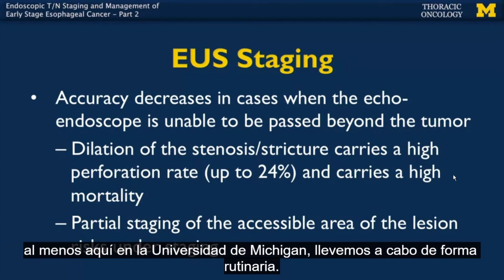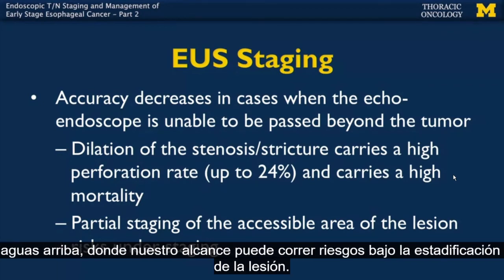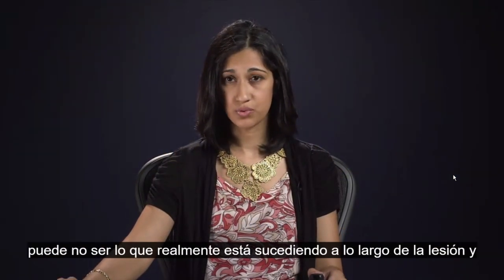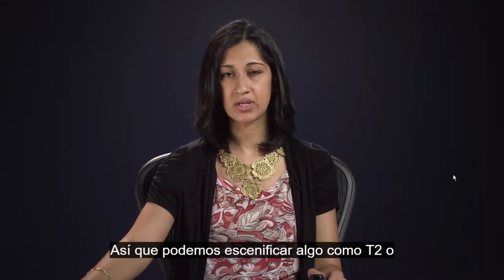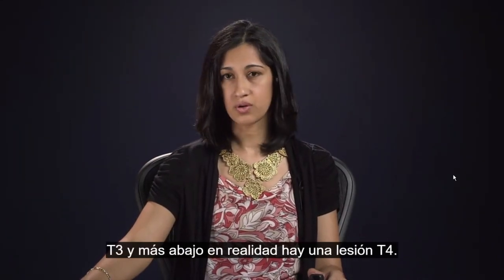Partial staging of the accessible area, meaning the area upstream that we can actually see, where our scope can go, risks understaging the lesion. What I mean by that is what we see up top may not be what is actually happening throughout the lesion, more distal in the area where we can't put our scope. So we may stage something as T2 or T3, and further down there actually is a T4 lesion.